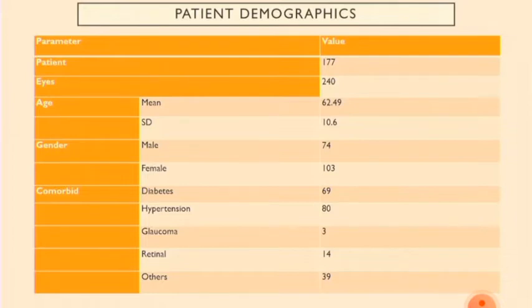He'll require glasses, and he'll be 20/40. He cannot be 20/20, because that's not going to happen. What we're doing here is, uncorrected, we're giving him the best outcome that that person at that point in time can have.